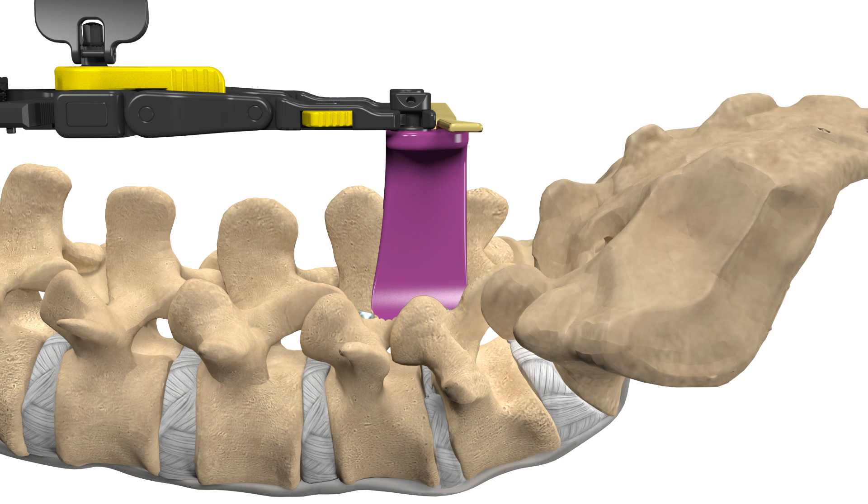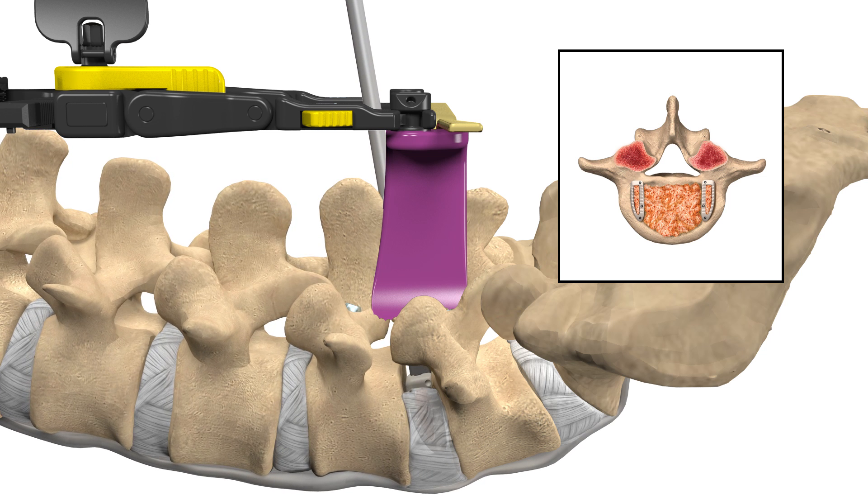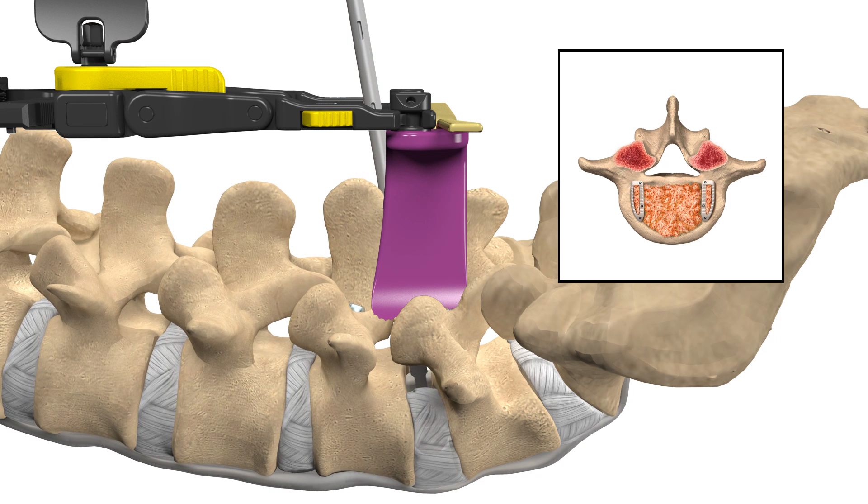Your surgeon will then remove the disc and prepare the disc space for fusion. Appropriate implants will be chosen by your surgeon. The implants, along with bone graft material, will be placed into the empty disc space to restore the proper disc height and assist in spinal load, alignment, and fusion.